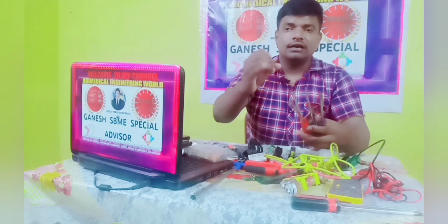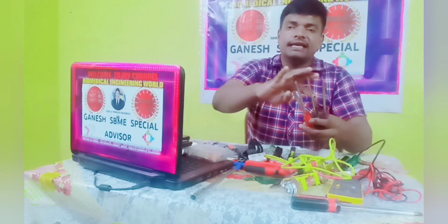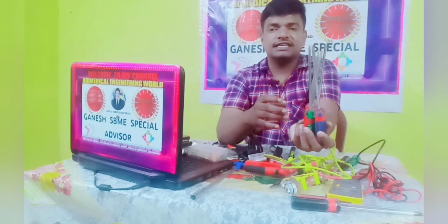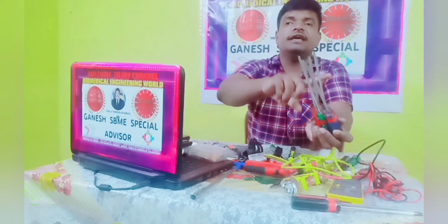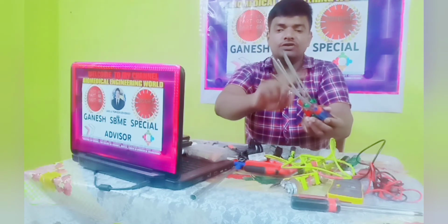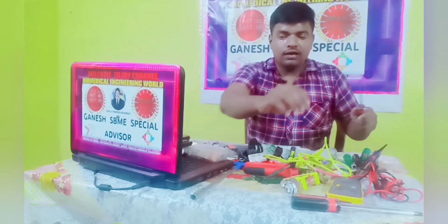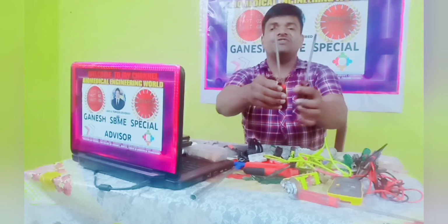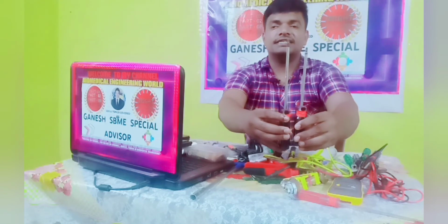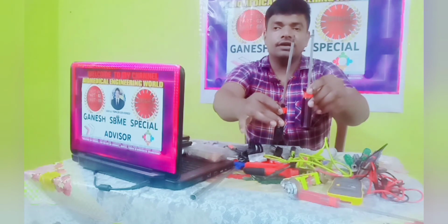So plus, big star, small star, big minus, and small minus. All these types of screwdrivers are used only for servicing medical equipment. Especially for opening, closing, removing and fixing, we use all these screwdrivers. Understand? In this, T10 or T20 are specific unique toolkits. These are very rarely used; few equipments, few companies design for that purpose. We can use this toolkit for opening and closing.